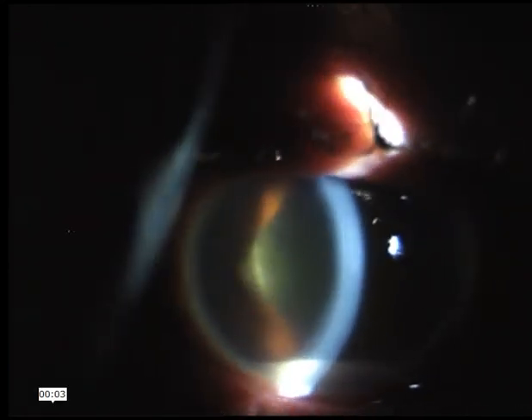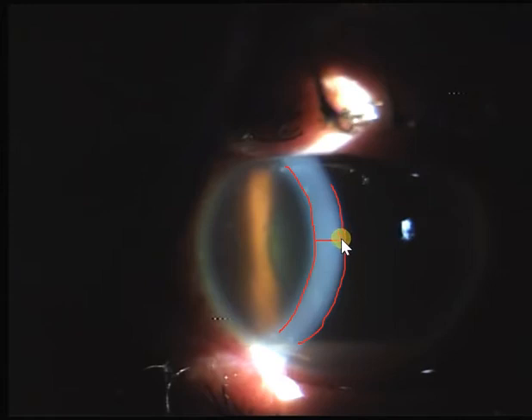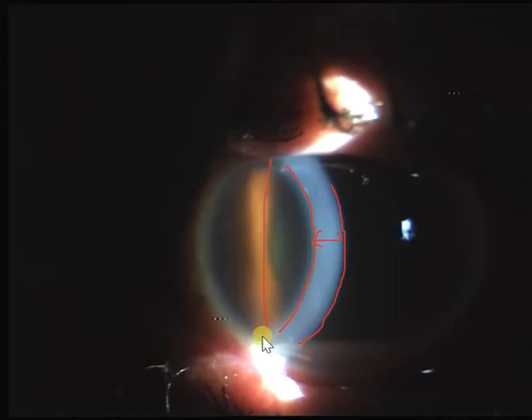The next thing I'm looking at is whether there is corneal edema. I think the haziness is more because of the anterior chamber compared to the cornea, because as the slit moves around, the surface of the cornea does not seem to be very edematous. Here you can see — if you make this beam broader — this is the broad beam, so the slit actually becomes broad. This is the area of the epithelium being shown; the endothelial slit is not very clear with a broad beam.